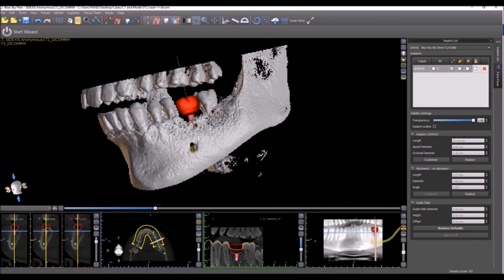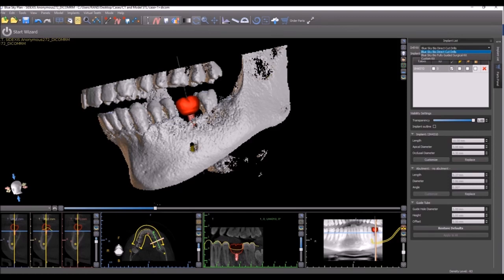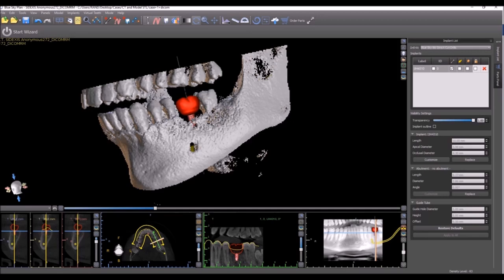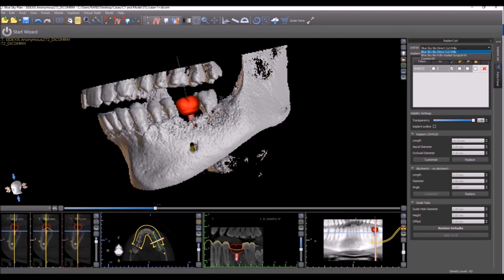You can see that in the implant list, there's now a new drop-down for drill kits. Here, you could select if you're using the direct cut drills, the fully guided kit, or if you're using another kit. And in the future, we're going to have additional kits listed here as well. And you could see, watch right now, we have direct cut drills selected, and look at the values in the guide, hole diameter, height, and offset. Now, if we make the change to the fully guided surgical kit, we could see how the data and information updates automatically.